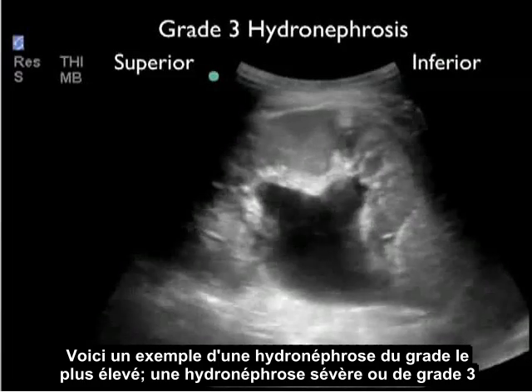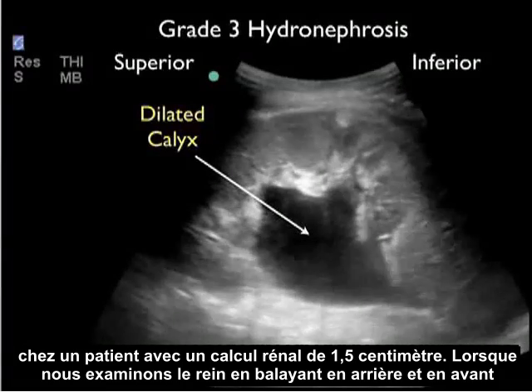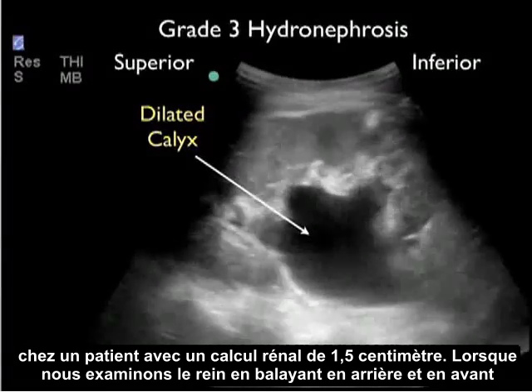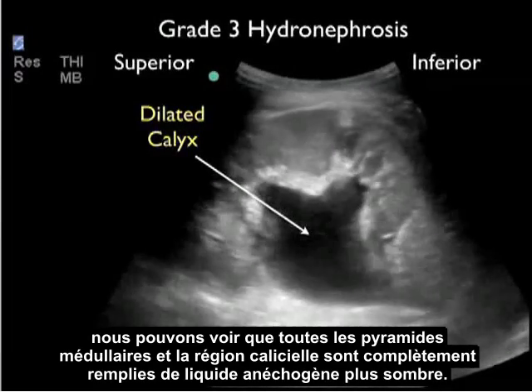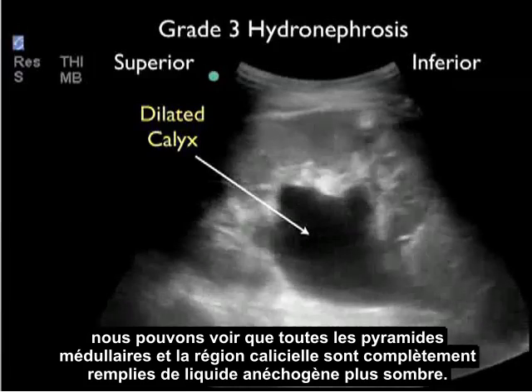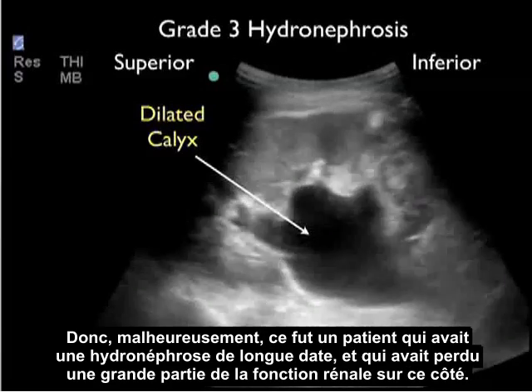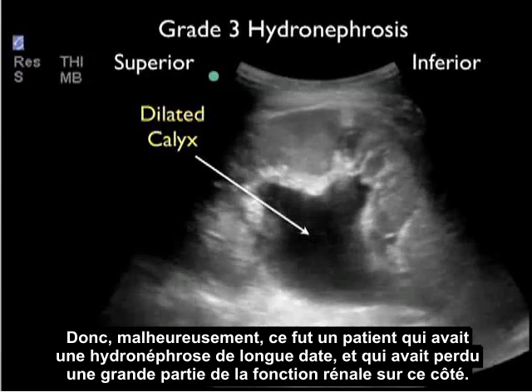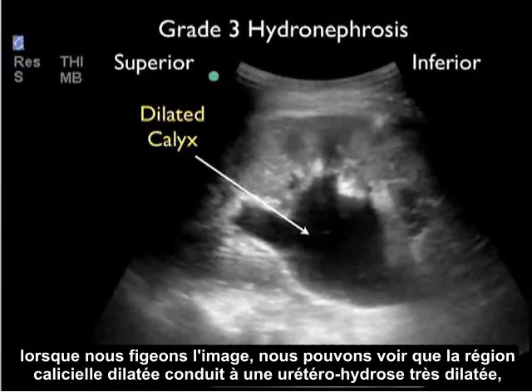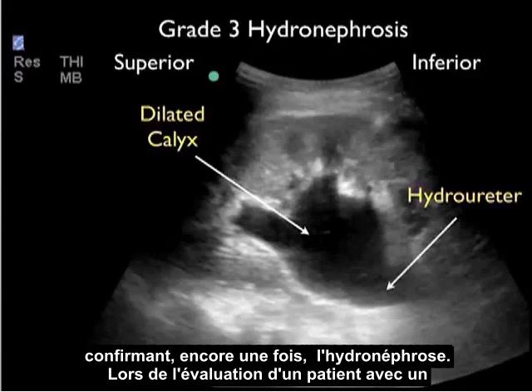Here's an example of the highest grade hydronephrosis — severe or grade three hydronephrosis — in a patient who had a 1.5 centimeter kidney stone. As we scan back and forth through the kidney, we can see that all the medullary pyramids and the calyceal region are completely filled with dark or anechoic fluid. All that's left is the outer cortex of renal tissue. This was a patient who had long-standing hydronephrosis and had lost a lot of kidney function on this side. As we still the image, we can see that the dilated calyceal region leads to a very dilated hydroureter, again confirming hydronephrosis.